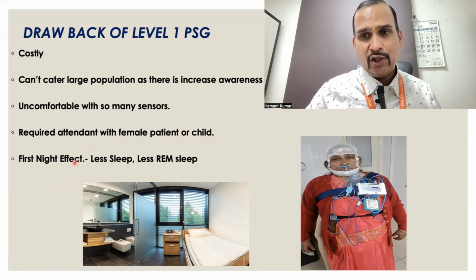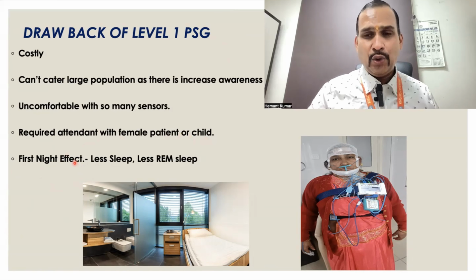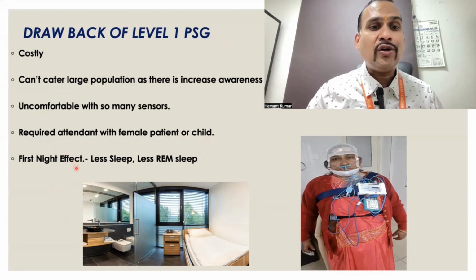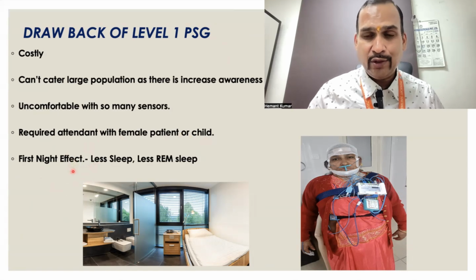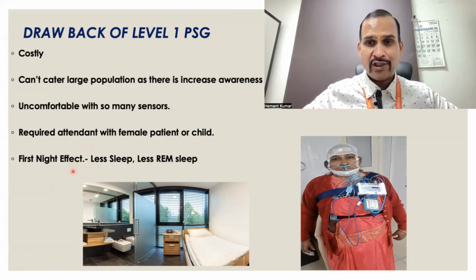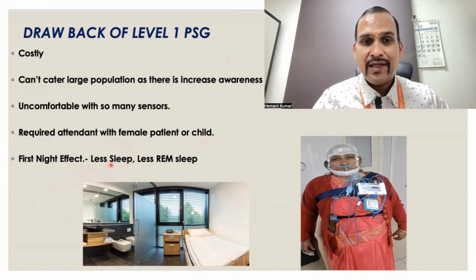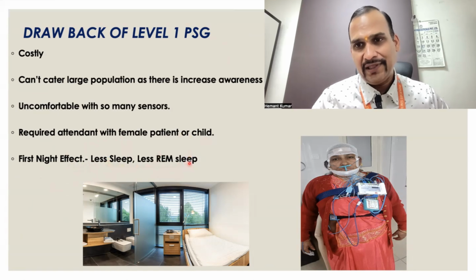First night effect. You must have heard someone say, oh, I couldn't get sleep at the hospital. I am very comfortable in my bed, but I cannot sleep at any other place. This is called first night effect. So patients coming for the first time to hospital for a sleep study may not have adequate sleep, may have less sleep and less REM sleep. This is the problem with a level 1 study.